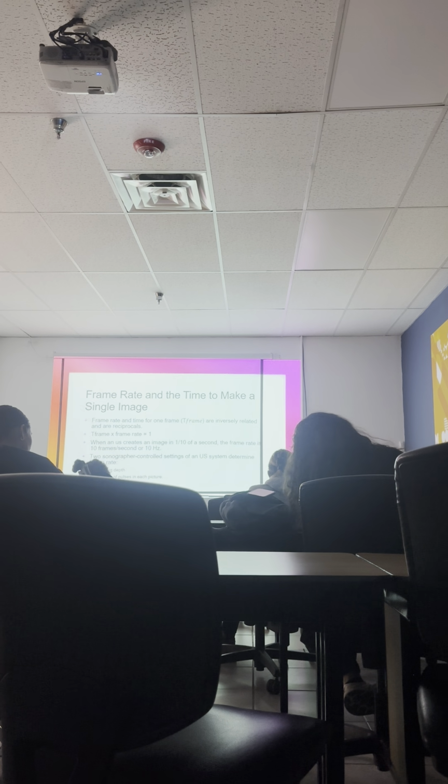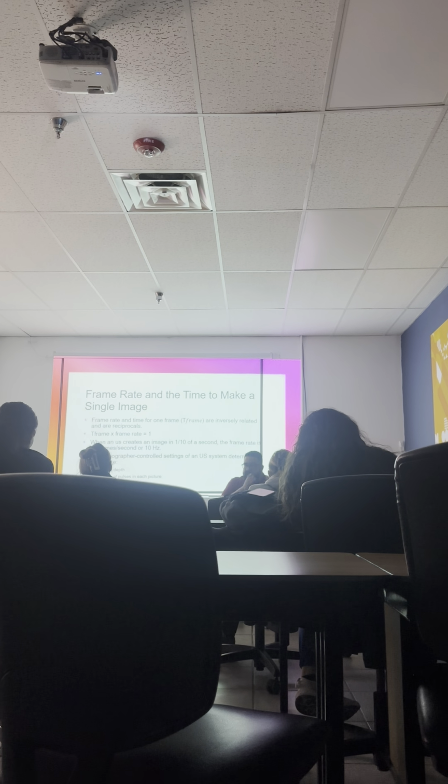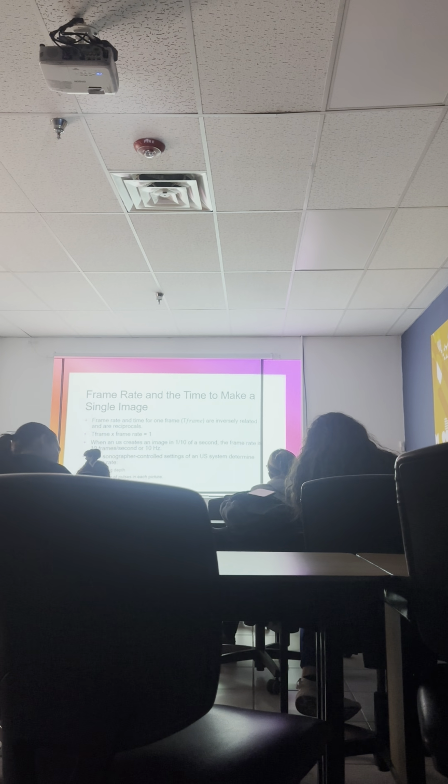No, no, no. So the frame rate is like the video, right? Have you guys seen, like on the iPhone, when you get a video and you edit it, it has a bunch of different slices? Each of those individual things is a frame. If you put it together, it makes a video. Now just imagine those frames being stretched out or shortened. That's a T-frame. That's the time it takes to make one frame. So frame rate and the time for one frame are inversely related and are reciprocals, or T-frame times frame rate equals 1.